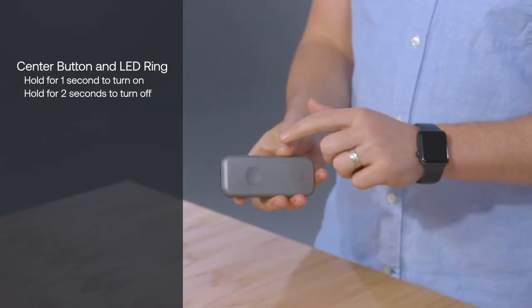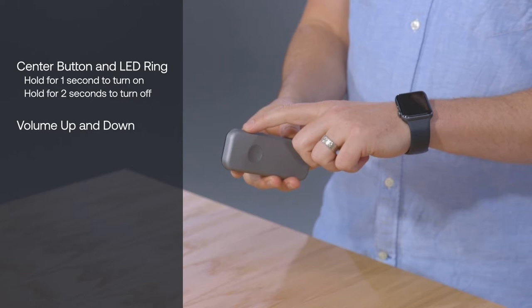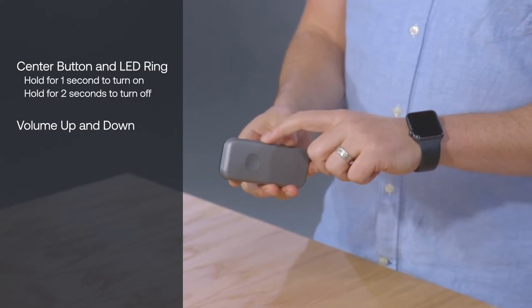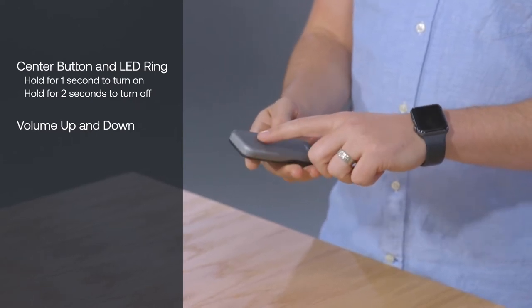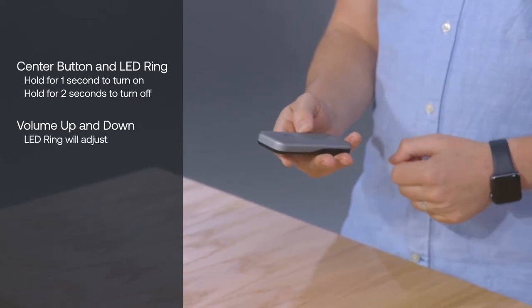On the side of the Duo are volume buttons up and down. You'll notice the LED ring adjusts relative to the volume.